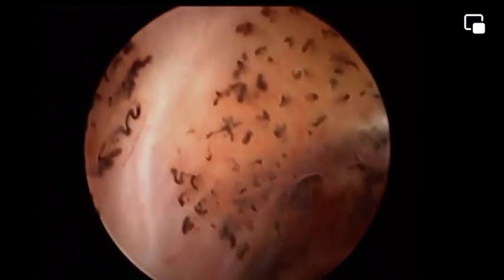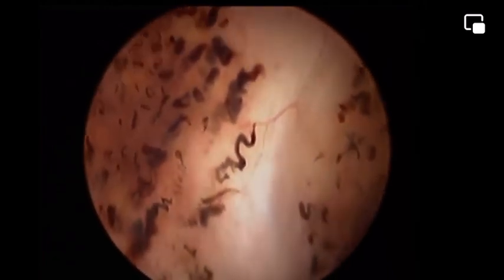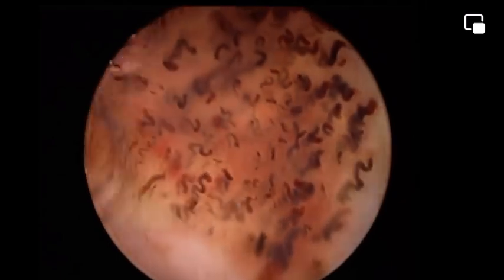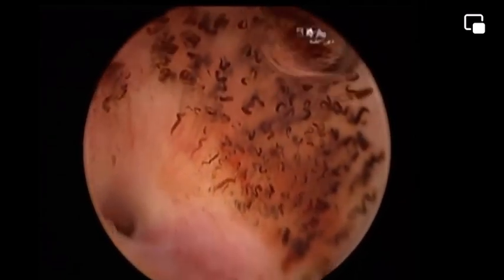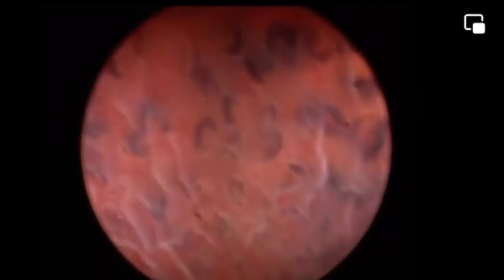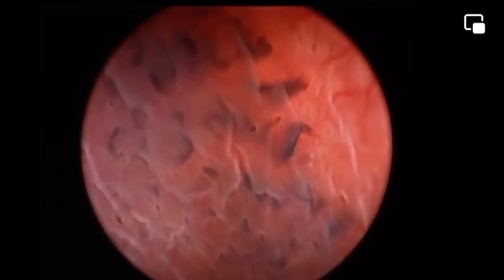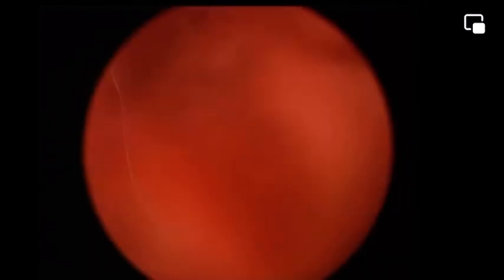Here you see an abnormal, bizarre endometrium. Look at this comma-shaped vessel. This is a dysmorphic endometrium. There are two opinions about these dark comma-shaped signs. Some people claim that these are thrombosed blood vessels. Others say that these are endometrial glands congested with blood. Up till now, I cannot give a clue without evidence, but this is a dysmorphic endometrium. Maybe taking a biopsy can help.